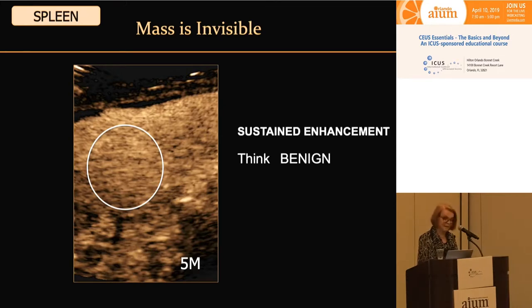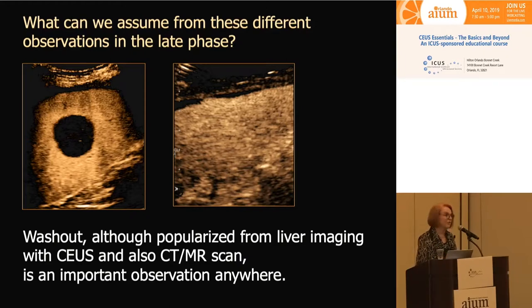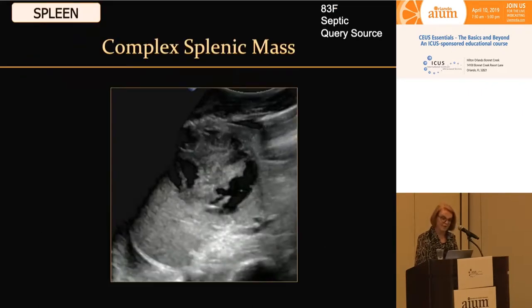What is it? I'm not sure — possibly a hemangioma, but I don't know. Doing labeled red blood cell scans of the spleen is not highly successful because you're looking for a blood pool tumor inside a blood pool organ. We don't know what it is, but we're not worried about it. What can we assume from these different late-phase observations? Washout — popularized from liver imaging with CEUS, CT, and MR — is an important observation anywhere. Washout on one lesion and sustained enhancement on the other.